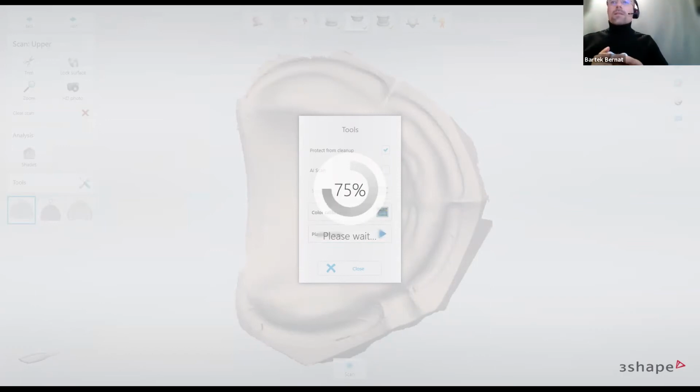So we're starting our process from the tuberosity area of one side and proceed along the center of the residual ridge towards the tuberosity area of the opposing side. So we basically scan the whole arch at one go. Okay, yep, let me just play it for you.